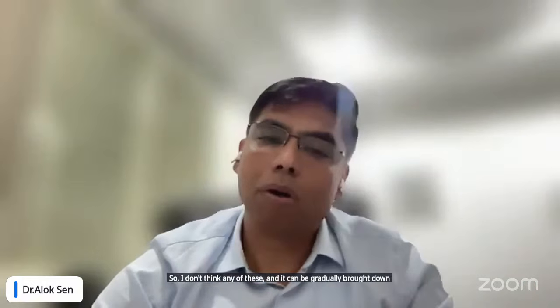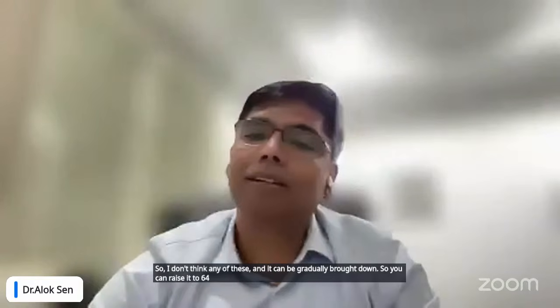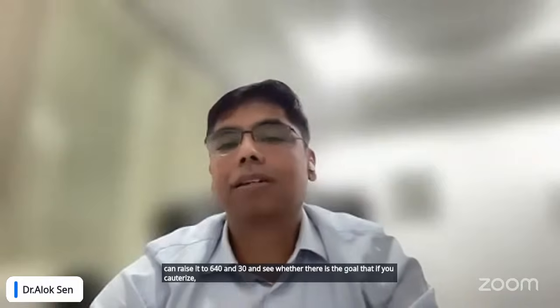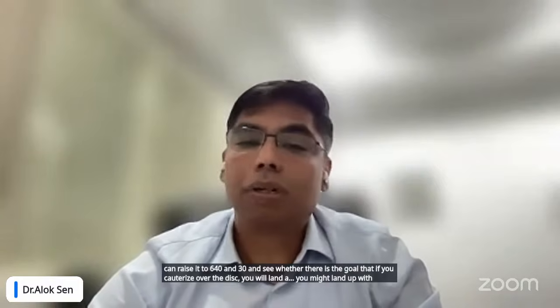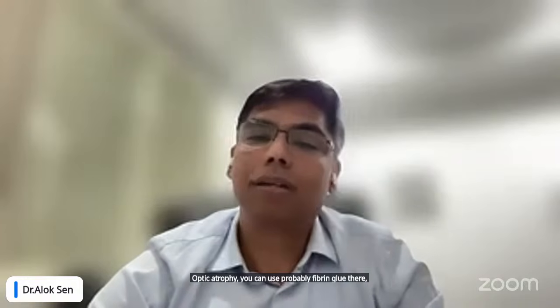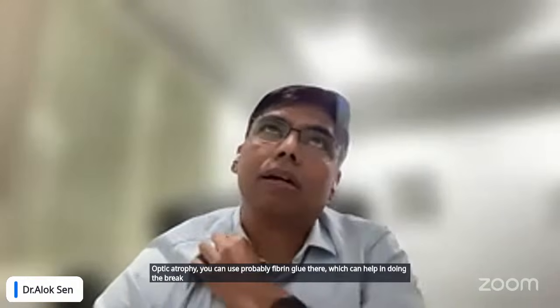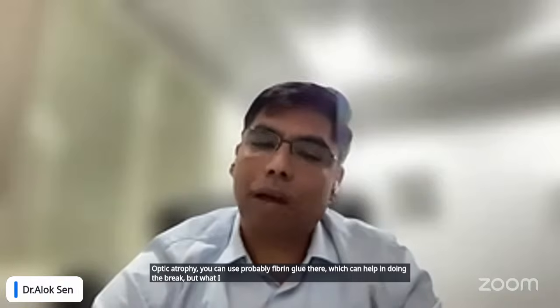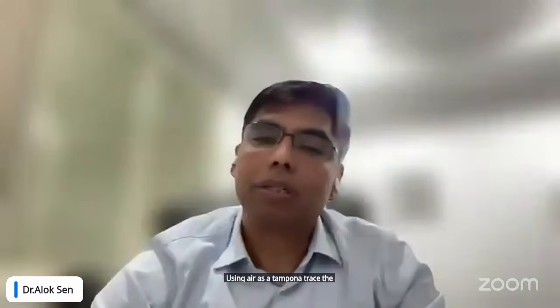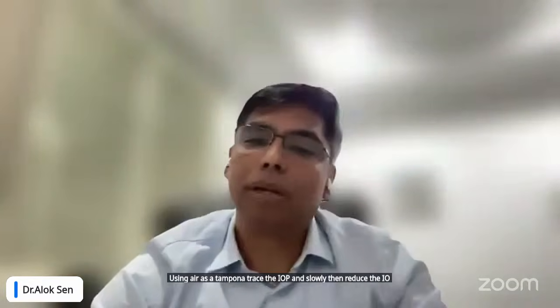So you can raise it to 40 and 30 and see whether there is bleed. I was told that if you cauterize over the disc, you might land up with optic atrophy. You can use probably fibrin glue there, which can help in stopping the bleed. But what I generally do is I do a fluid-air exchange, using air as a tamponade, raise the IOP and slowly then reduce the IOP so that the bleeding stops there.